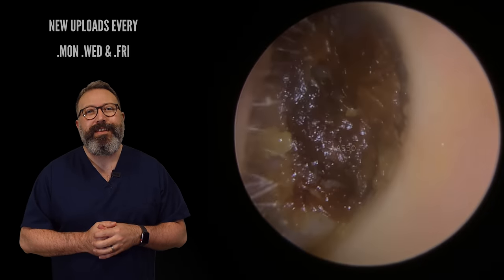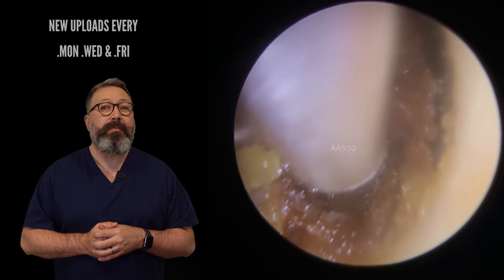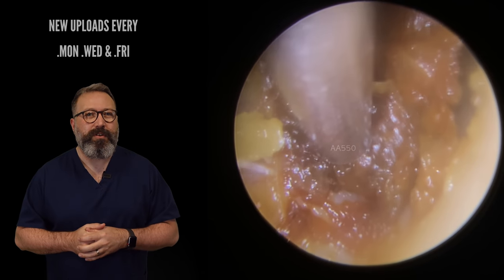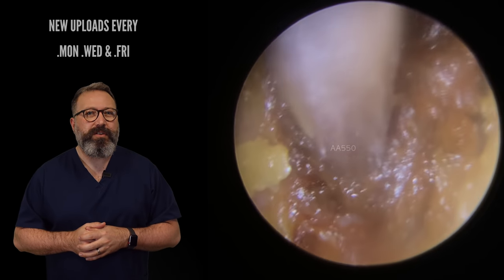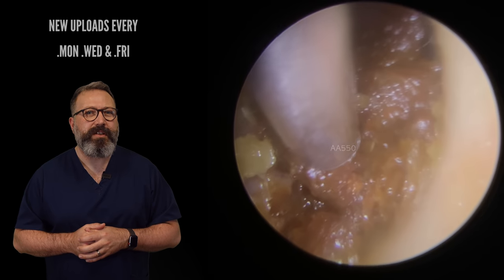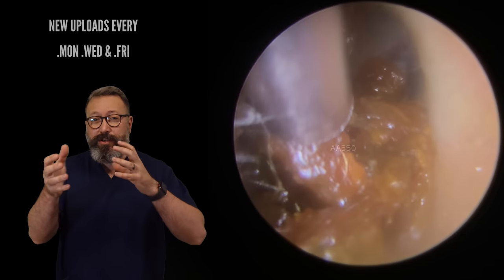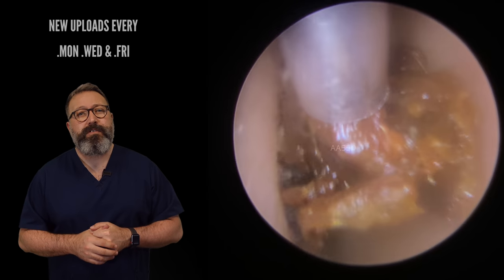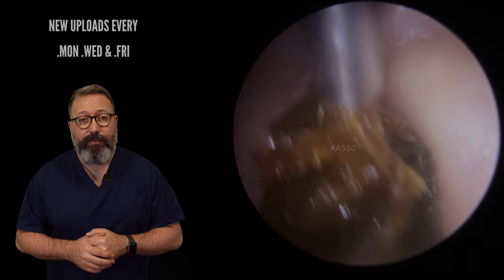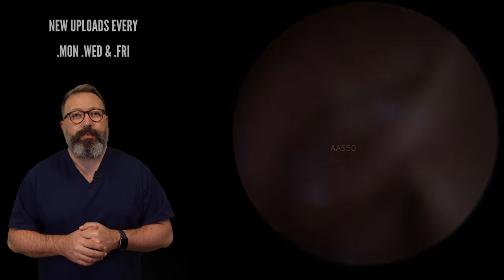There is a little tiny gap down the one side of it. The patient has been noticing their hearing improved a little bit recently — after using a bit of olive oil, it's just loosened it, taking it away from the side of the canal wall a little bit. We're trying to hold on to this — really all starting to pull forwards nicely. So holding on to that plug, a little bit of a wiggle just to detach it from the canal walls, and then very, very slowly bringing this down the canal. It's a bit like quick fire wax removal, this one — they're all quite short ones today. Nice little plug, that one.